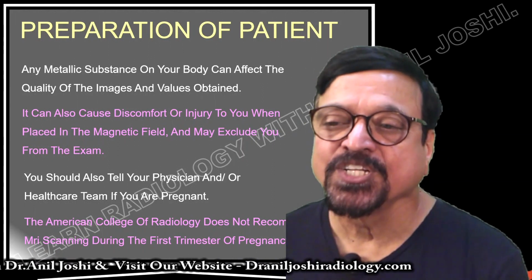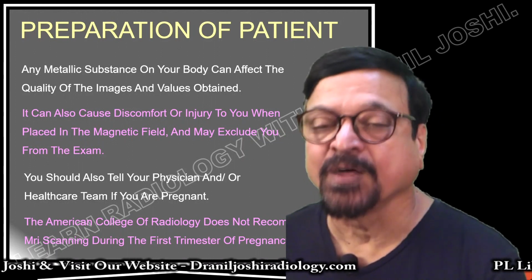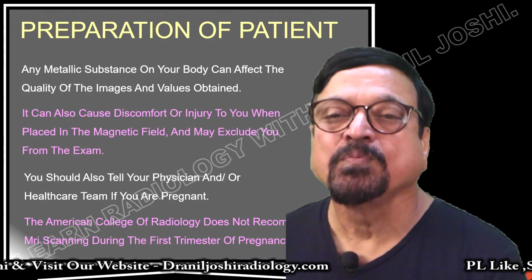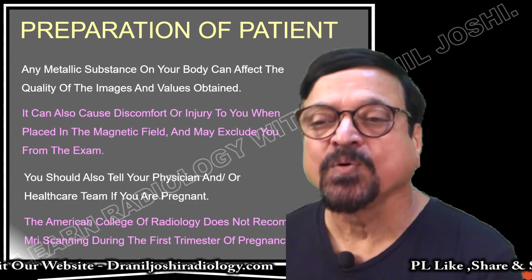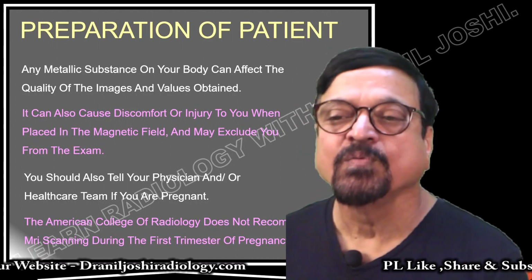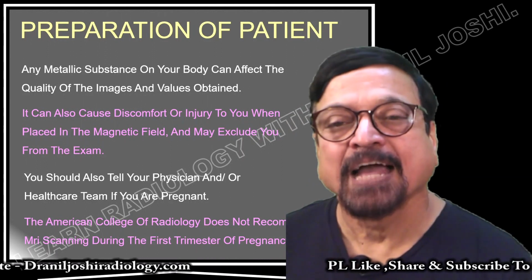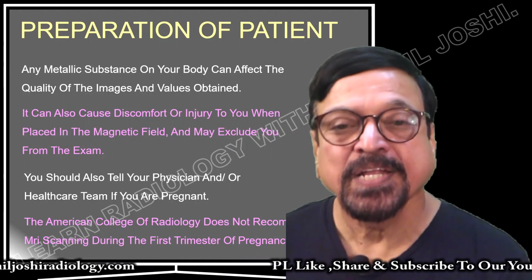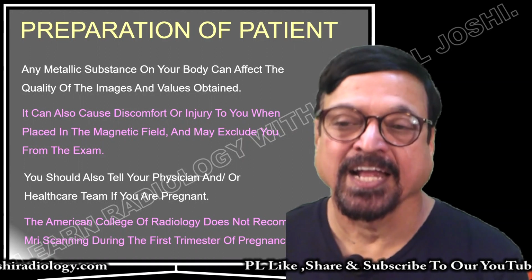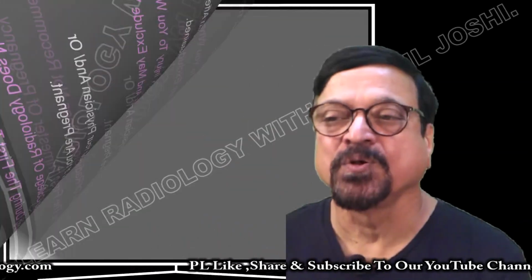In the United States, they do not allow MRI in the first trimester. However, to our knowledge, to our reading, there are no papers, there are no established statistical data which have proved any abnormalities or any effects on the fetus during the first trimester by the MRI. However, due precaution has to be taken, rules have to be followed.